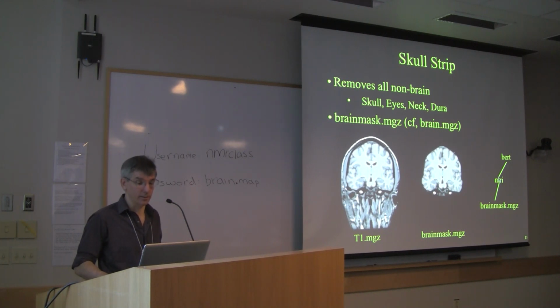And so this can sometimes also fail by removing too much or not removing enough, and that might require manual intervention. When it's done, it creates a brainmask.mgz file. So it takes the t1.mgz as input and creates a brainmask.mgz.